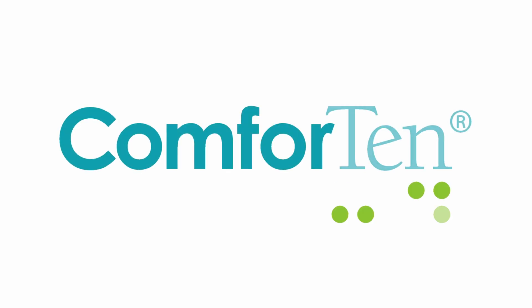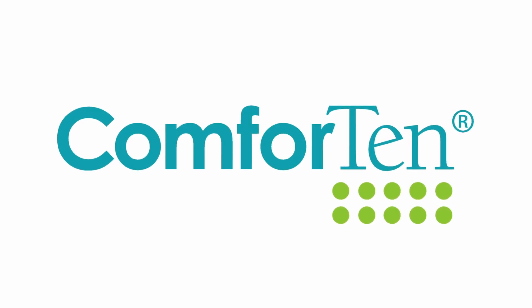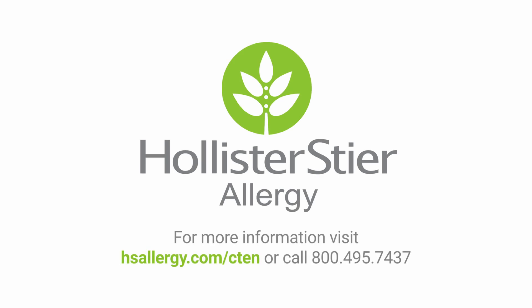Hollister Steer is proud to bring you the Comforten multiple skin test system, designed to diagnose allergies comfortably and effectively.